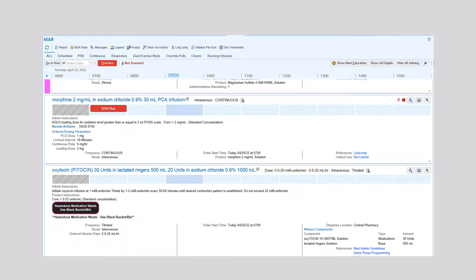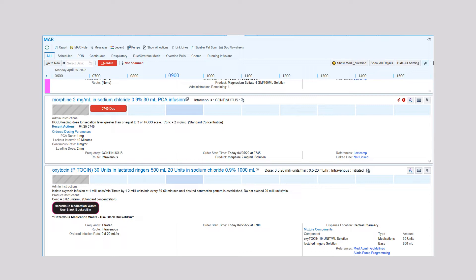Here you'll be looking at the order set. And you scan just as we do for any other medication. On the left hand side here under the morphine you'll see the PCA dose, the orders for the lockout interval, the continuous rate, which in this case is zero, and the loading dose is 2 milligrams. Usually by the time we get the patient the loading dose has already been completed.